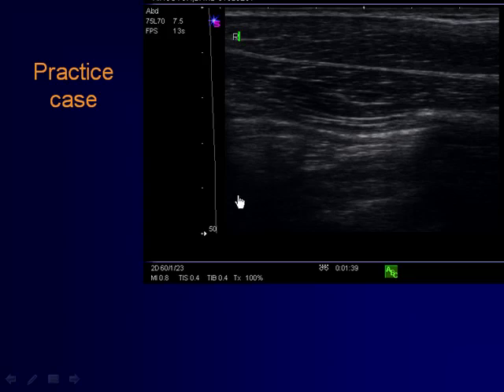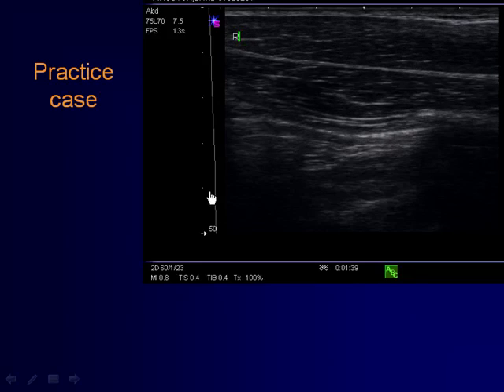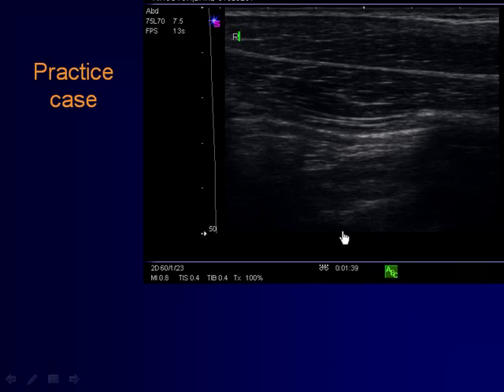In this slide here, we have a rib apparently here without the clear undersurface, but the shadowing is clearly appreciated. We don't have a rib to be seen here, and it's really hard to be sure of what this exam reveals.